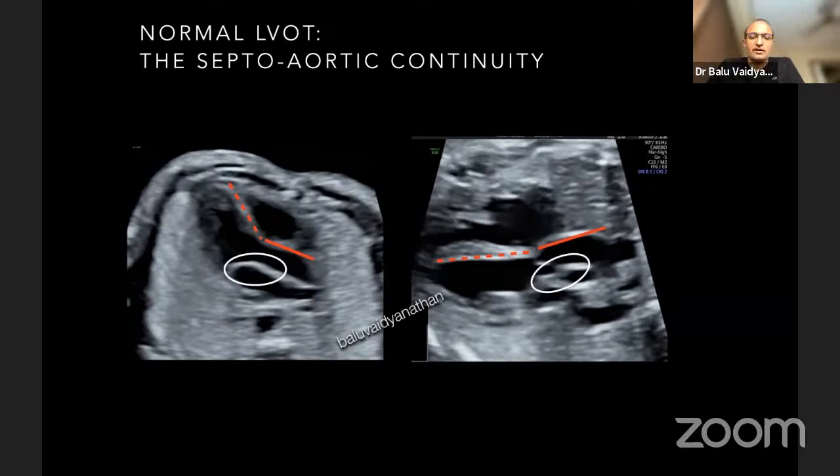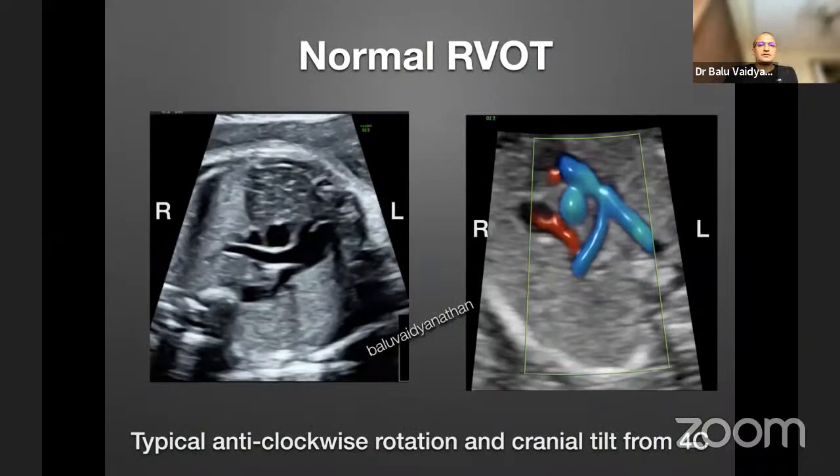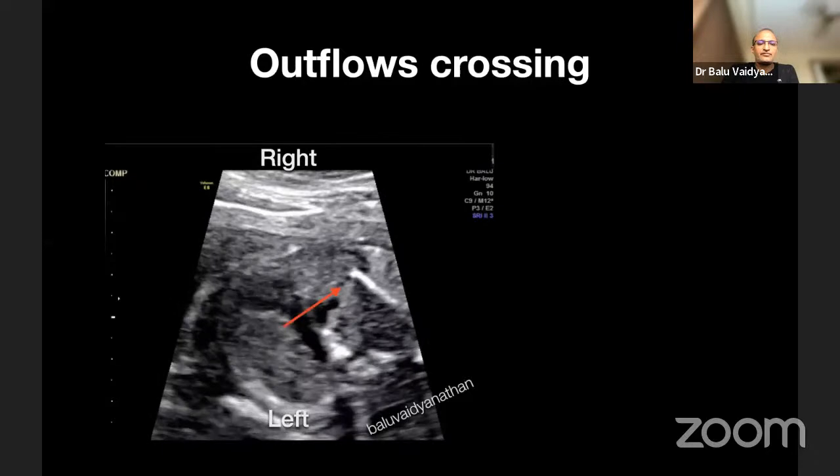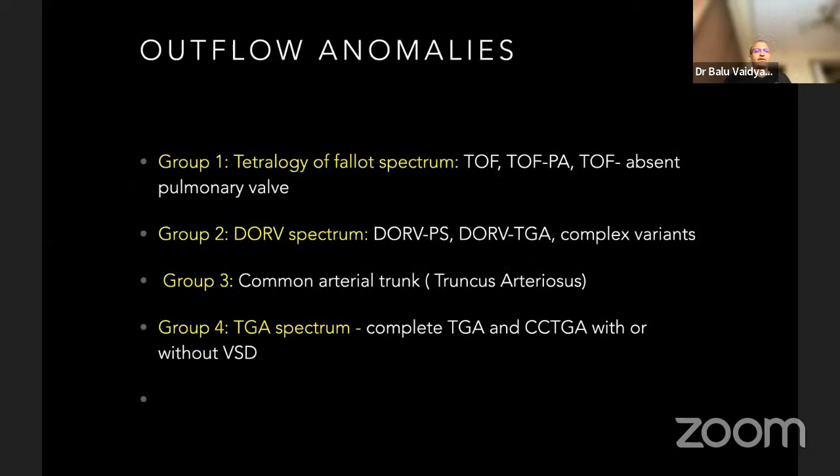Now this is the RVOT, and we saw the outflow tracks crossing. These are the three basic concepts in the outflow track views which we want to see. Let us look at the various anomalies and see how these things differ. The important four lesions we need to understand in the outflow anomaly group are: the tetralogy of Fallot spectrum, the double outlet right ventricle spectrum, the common arterial trunk, also called truncus arteriosus, and transposition.